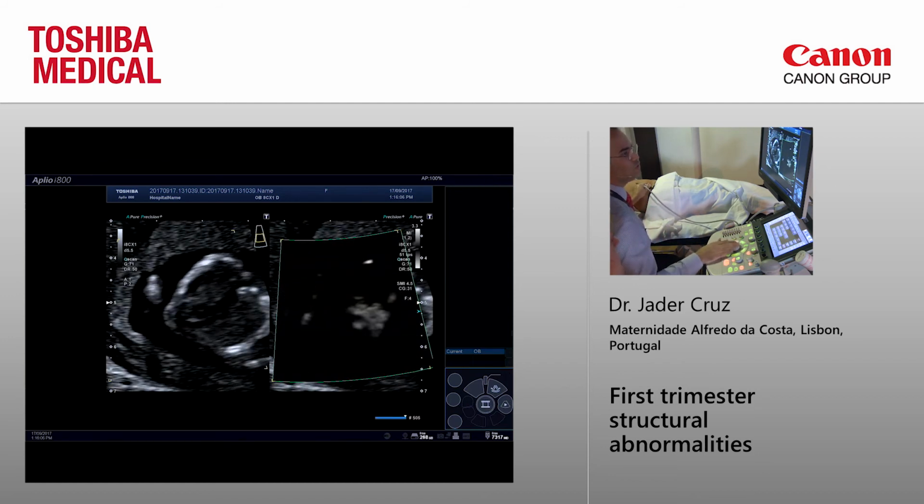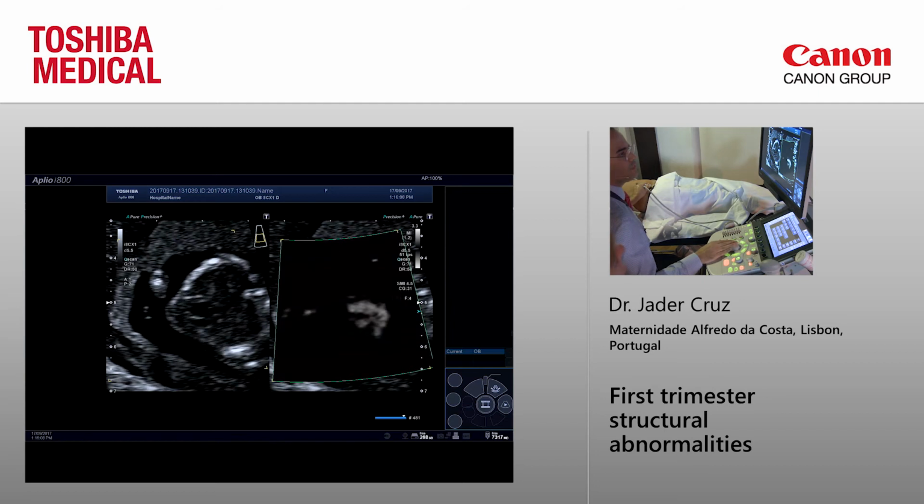That's good. I wanted to show you that. Look at this image of the four chambers there. You see that in the 2D you don't really see very much. There's something about the SMI that actually works in our favor. A normal Doppler depends a little bit on your insonation angle. SMI doesn't have this kind of condition that the normal Doppler has. Less. It has less, yes.